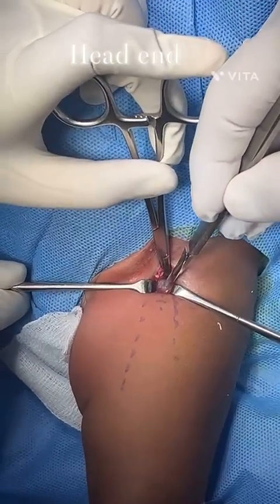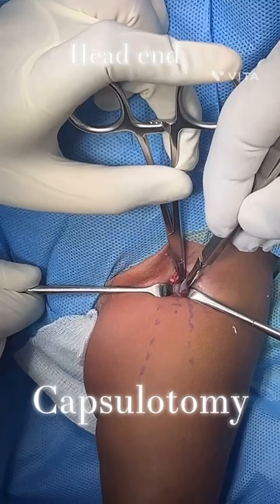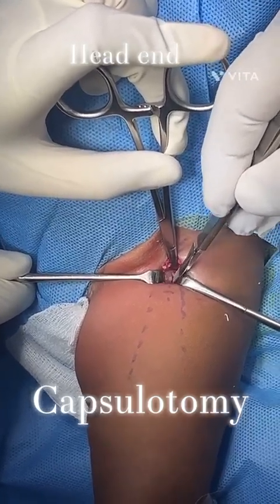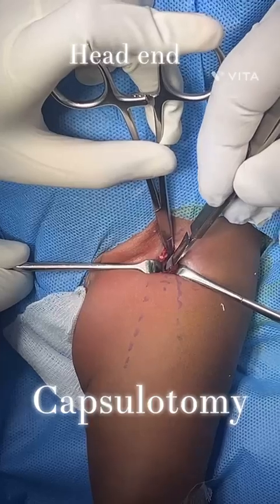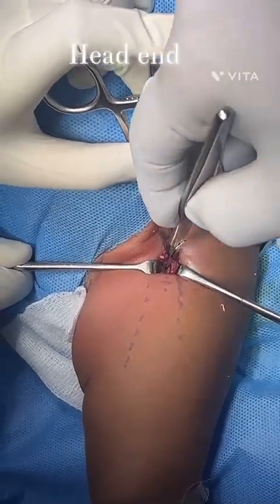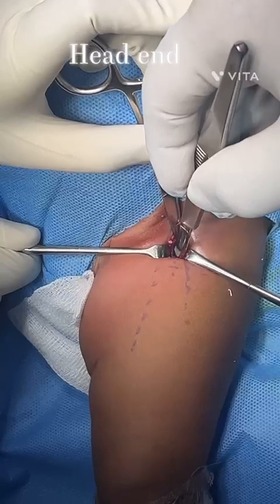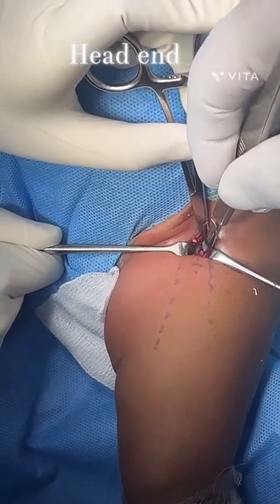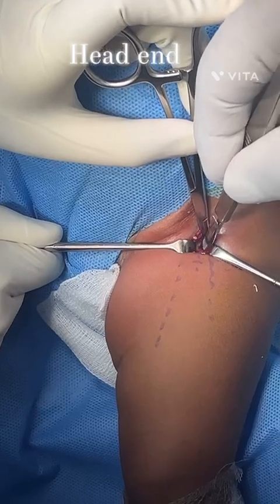Capsulotomy. Ideally, we make a cruciate incision and excise a part of the capsule. And we direct the blade laterally, away from the medial structures which lie on the medial side.